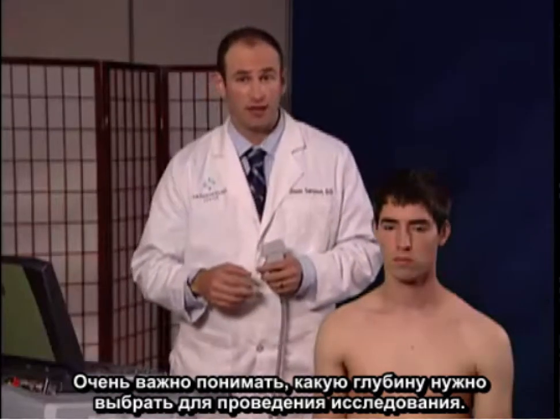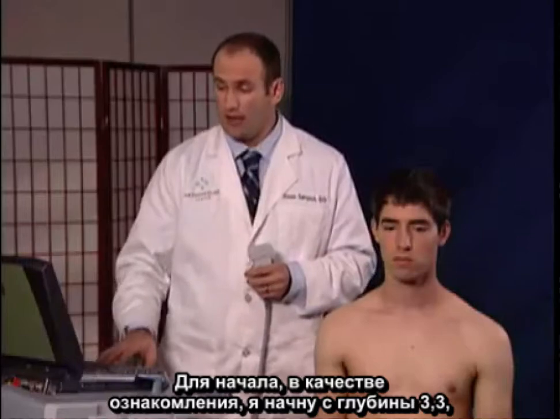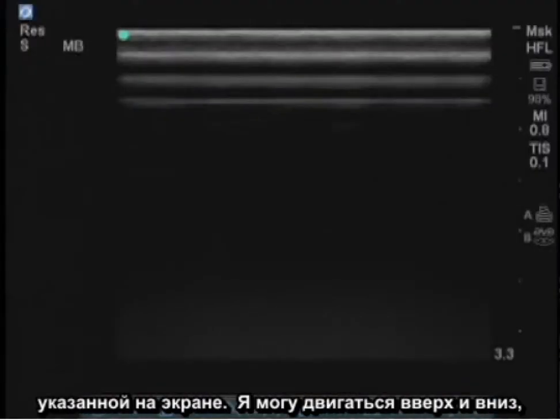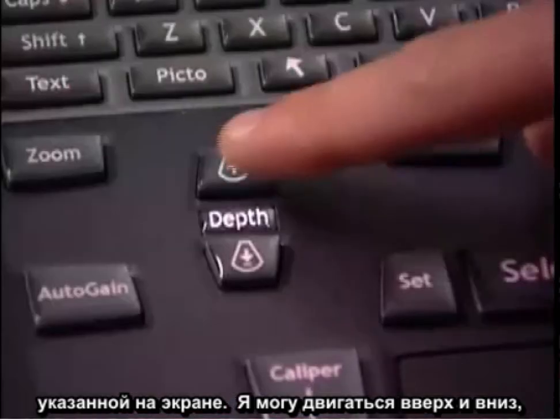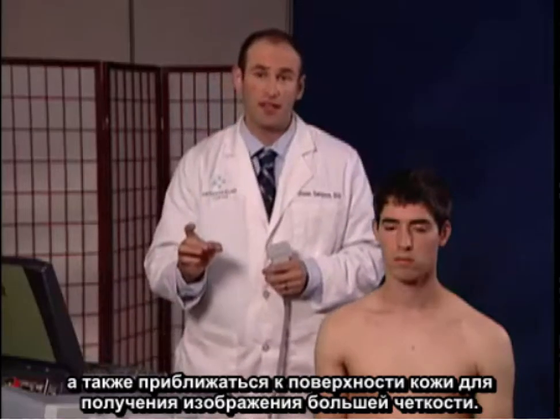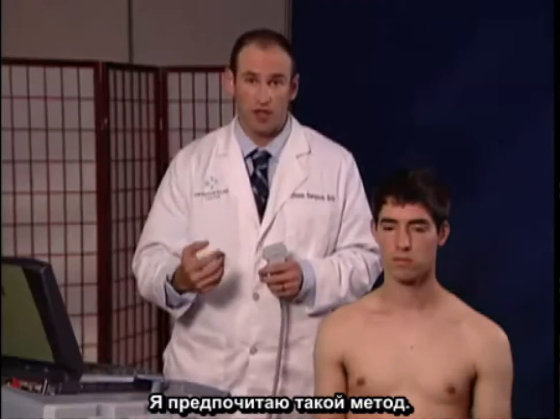Next, it's important to know what depth you'd like for the exam. For starters, I'm going to begin at 3.3, which is noted on the screen. I can move up or down, and the closer to the surface of the skin, the better clarity and resolution I'll have.